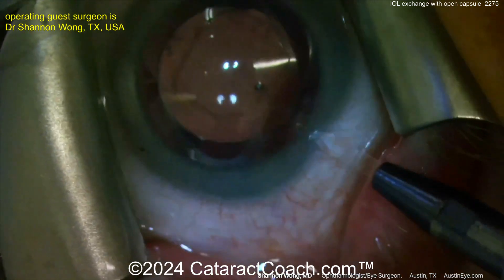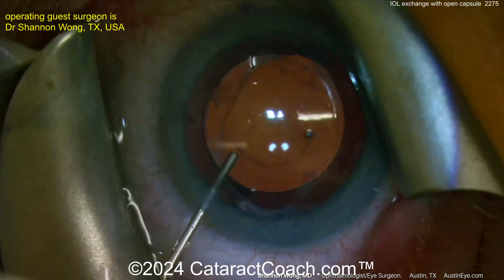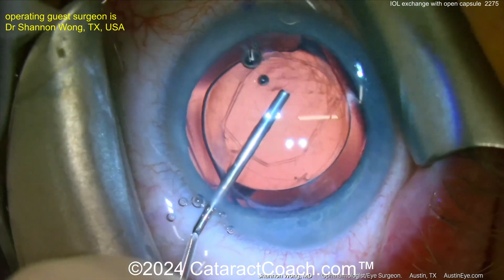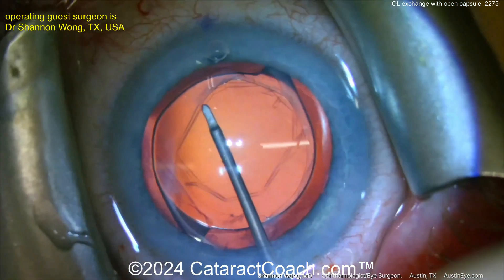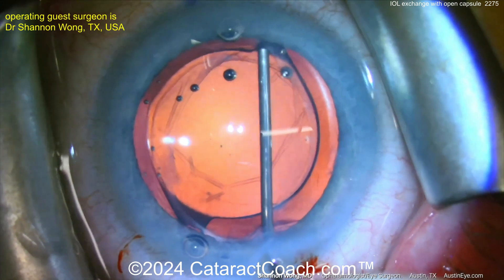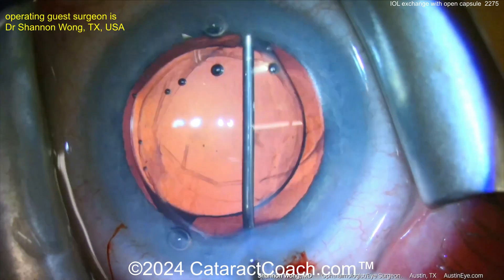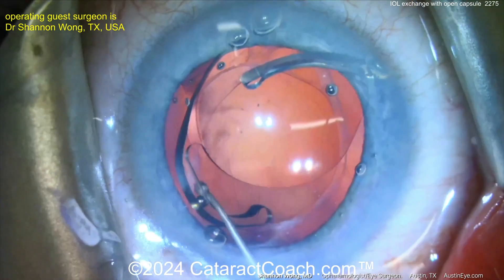Here on the OR table you can see the IOL in the capsular bag, which already has a YAG laser posterior capsulotomy done. Some viscoelastic is going into the eye. Like any other IOL exchange, we're going to do a visco-dissection using a dispersive agent — get underneath that anterior capsule rim, get some viscoelastic going around to help create a barrier effect between the vitreous.